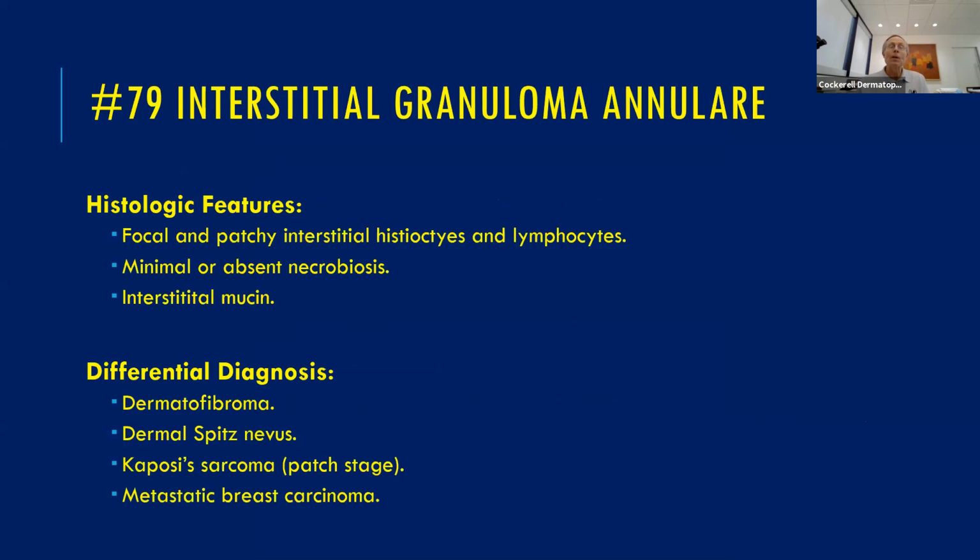And there are a lot of different other forms of GA than the interstitial type, or maybe the type that gets induced by a drug, or the type that maybe gets induced by an insect bite. Anybody know what some other clinical and histologic manifestations of GA are? So we've got the classic ring palisaded form. We've got these forms we talked about. You can get a diffuse form. Deep GA, also known as pseudo-rheumatoid nodule, subcutaneous GA, perforating GA, good. Those are like little skin-colored papules with some crust on the surface of them. So yeah, there are a lot of GA.